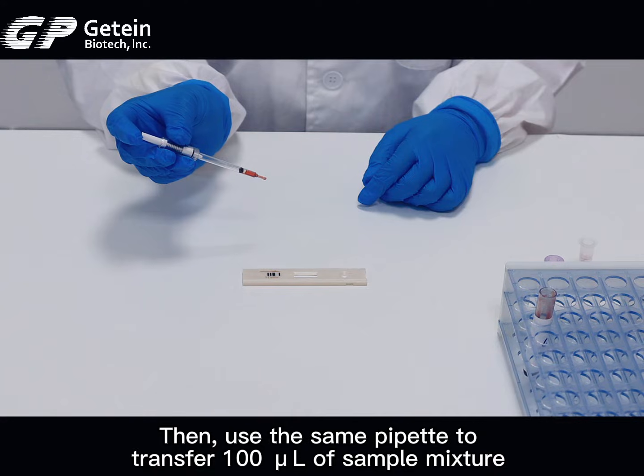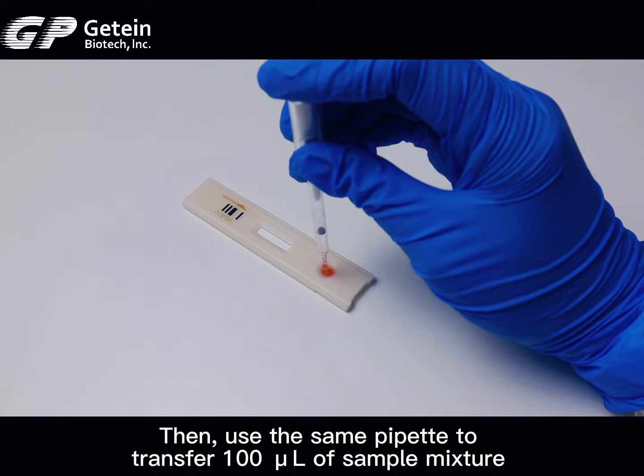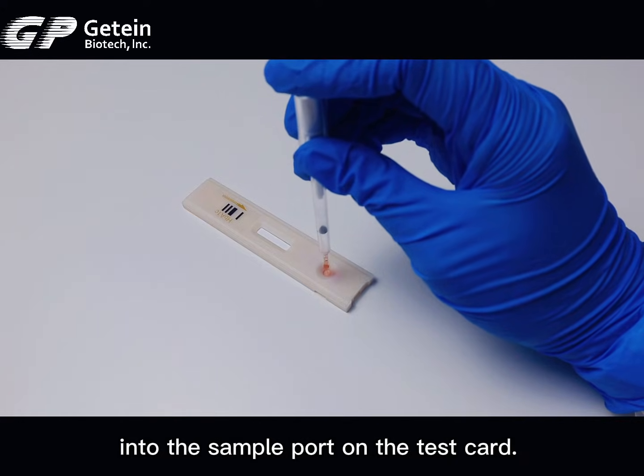Then use the same pipette to transfer 100 µL of sample mixture into the sample pot on the test card.